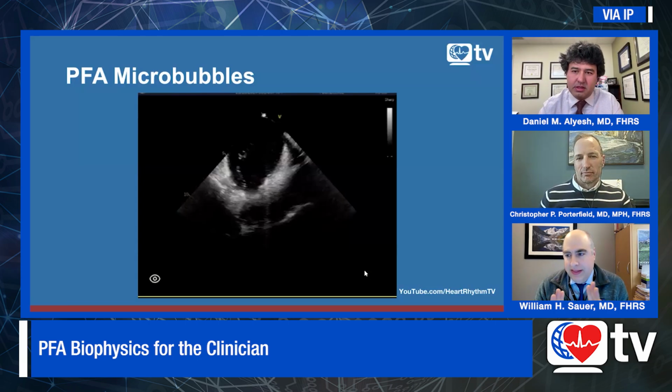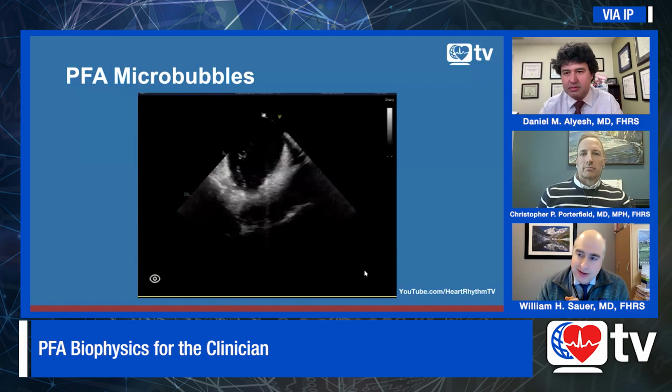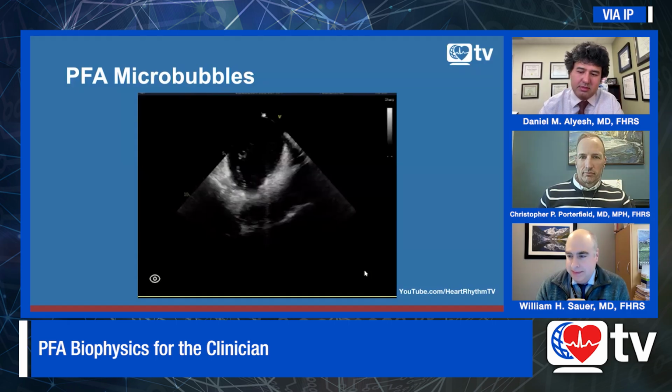I think that if it ever happens, everyone is going to hear about it, of course, but I have a fair amount of healthy skepticism when someone says this energy source works better on this tissue as opposed to this tissue, because I now see it didn't hold true for the hemolysis thing.